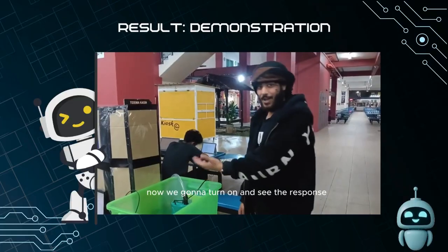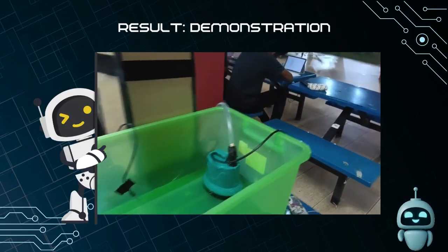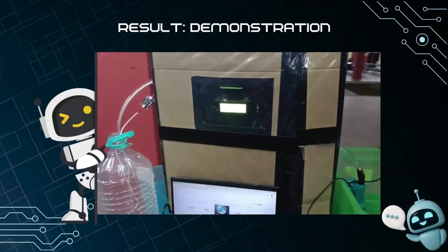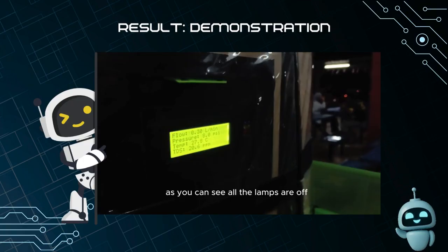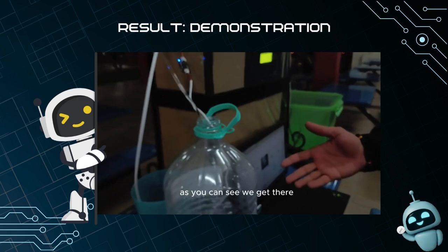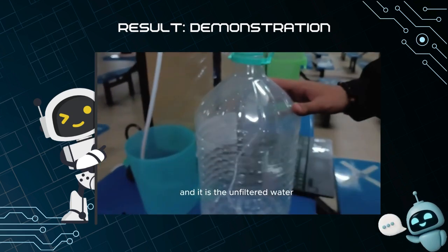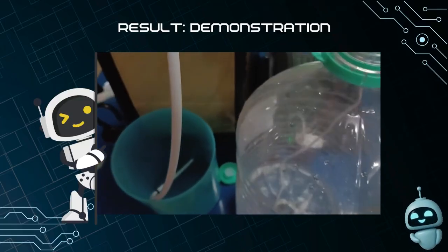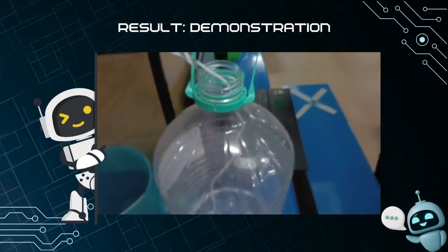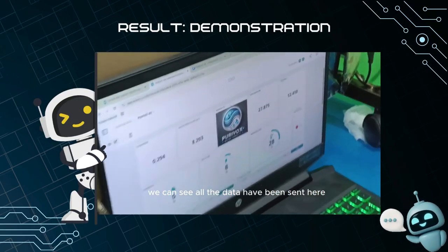Now we're going to see how it works. As you can see, all the lamps are off. This means that the sensor has measured numbers, and the numbers are right. Here, as you can see, we get the good quality water, which has been filtered, and this is the unfiltered water. Using Arduino IoT Cloud, we can see all the data have been sent here.